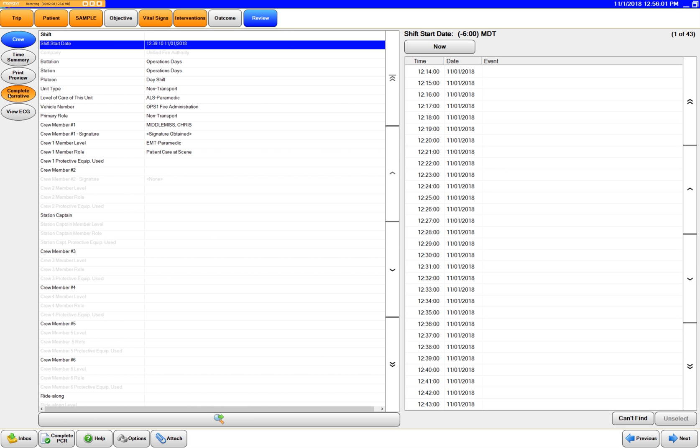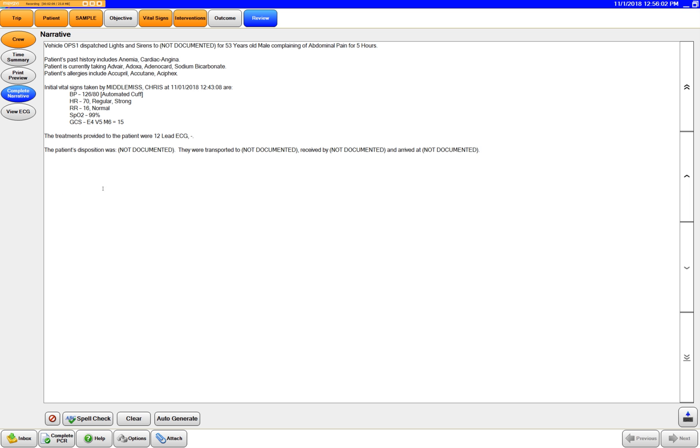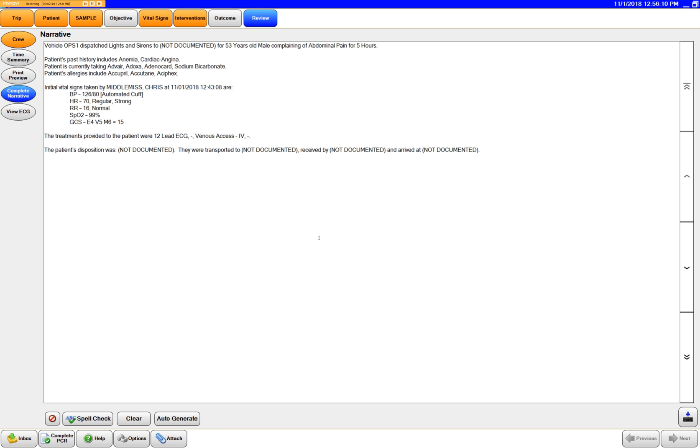And then go back to your narrative. You just hit auto generate again and it'll ask you if you want to replace the current narrative and you just hit yes.